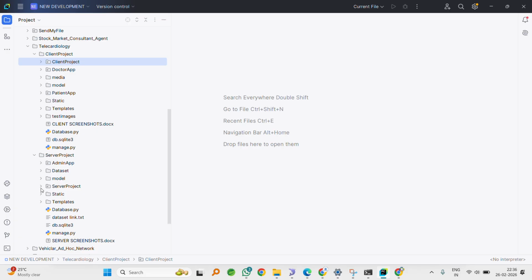For that integration purpose I will help you. Now I'm asking about that echo that was not added. We have told you two things, right? One is the ECG analysis, and the other one is the echo model.